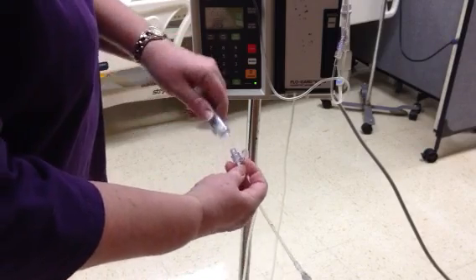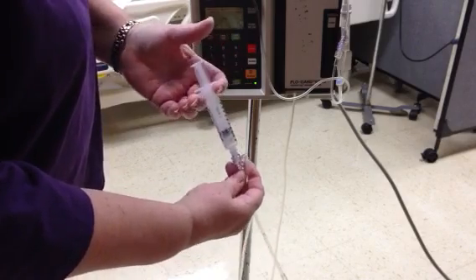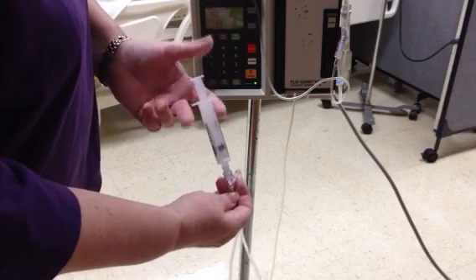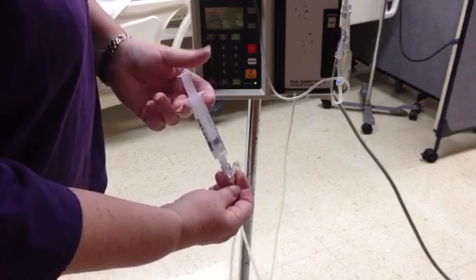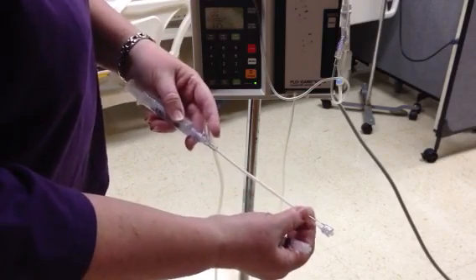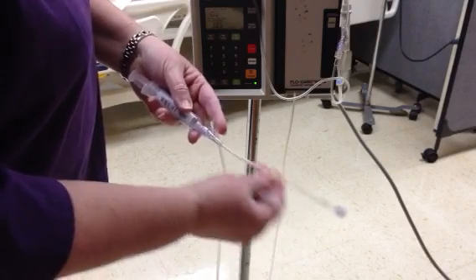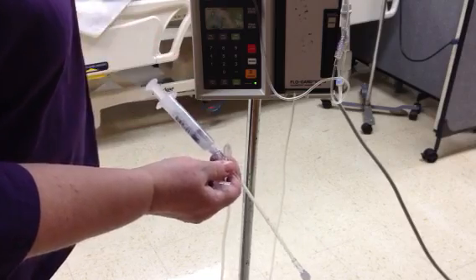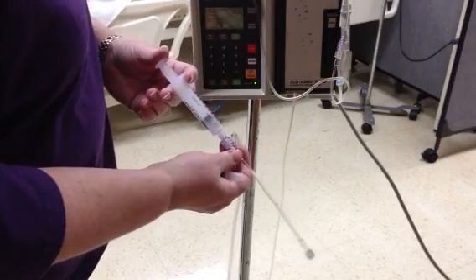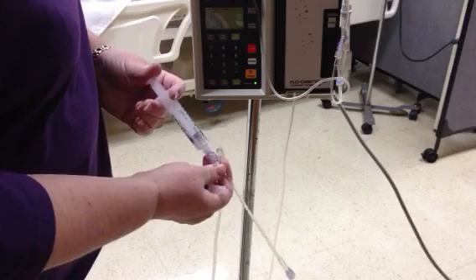And then I'm going to come back, and I again have done another math problem to figure out how fast I need to push this first milliliter. And I'm going to again push one line, wait the allotted seconds, push one line, wait the allotted seconds. I may, because I've got a fairly long length here, do that for 1 to 2 milliliters. And then once I've hit that 1.5 to 2 milliliters of fluids that I've already pushed in, then the last milliliter I can push in a little more rapidly.